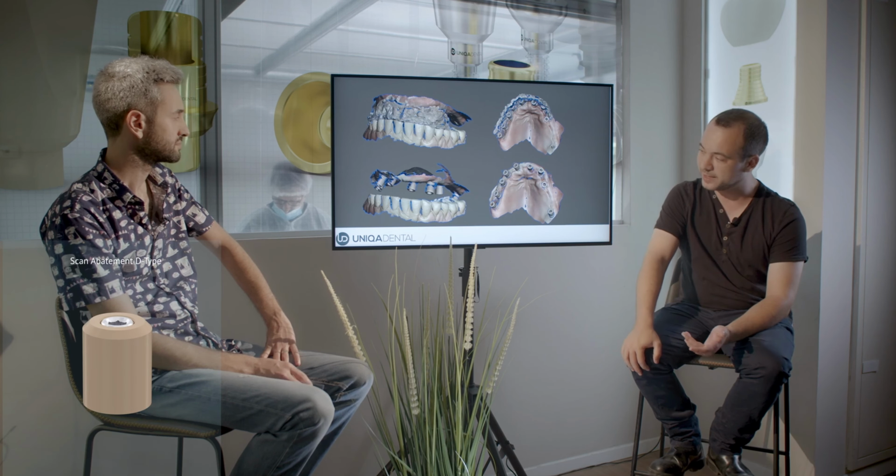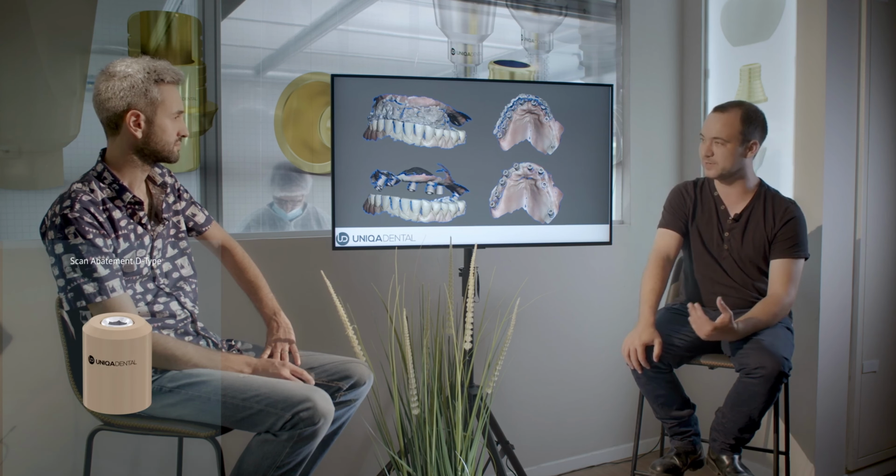For example, in here you can see we took interocclusal relations using the CAD/CAM technology. Now, what does the CAD/CAM technology give us that we didn't have previously? First of all, we're having here scan abutments. Doesn't matter right now on what type of parts we have the scan abutments, but we want to have these kind of abutments on the upper jaw, and we want to have them in relation to the lower jaw.